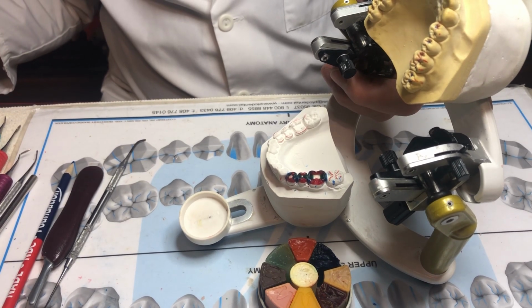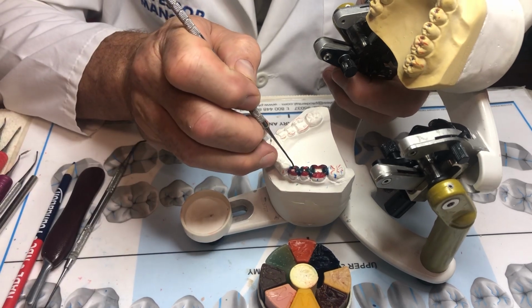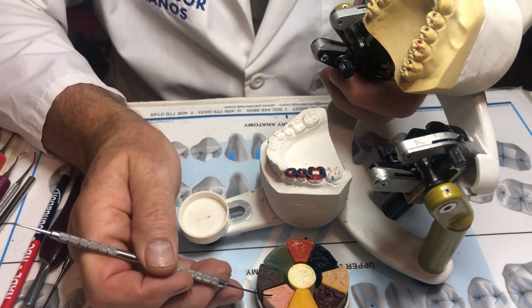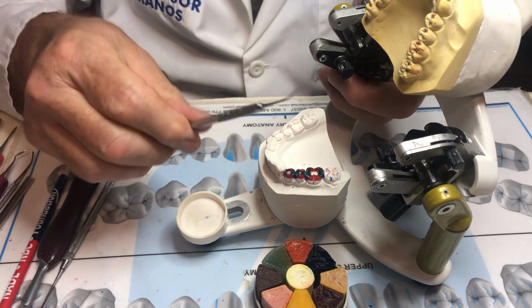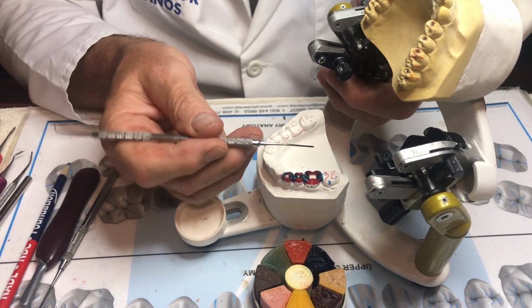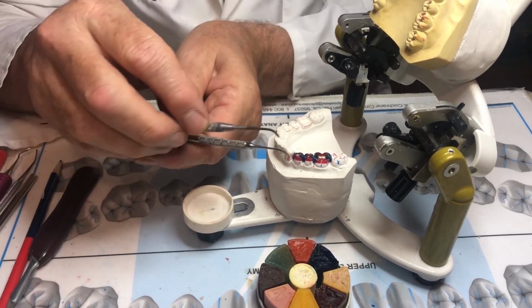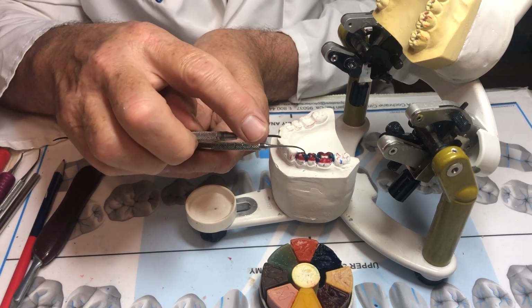I noticed the PKTs that most of you have are way too fat. So in the beginning of the course, as we're articulating, if you come up one at a time, I'll take your PKT instrument, I'll bring it over to the bench grinder, and I'll taper it down so you have a nice skinny tip. I'm sure most of your tips look like this one, compared to what I have. Big difference. You can't possibly wax with anything like this.